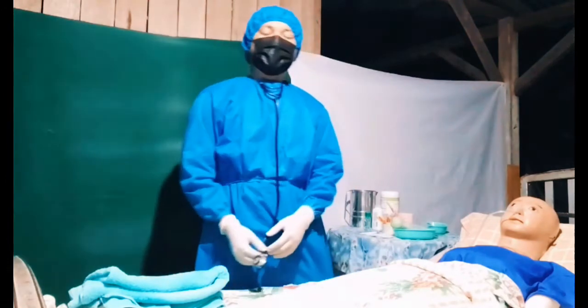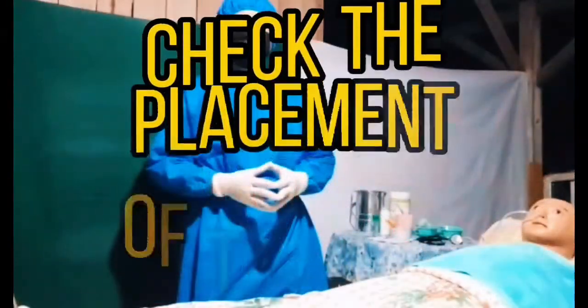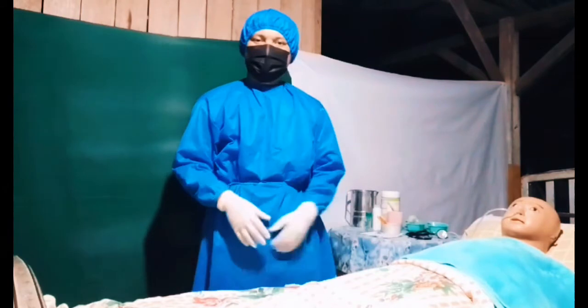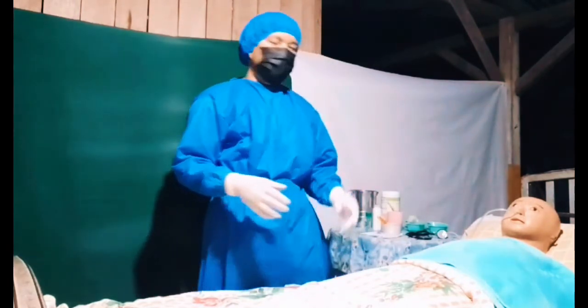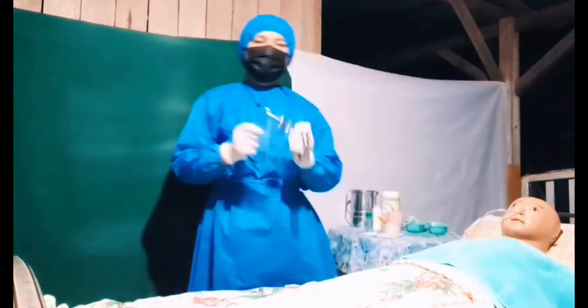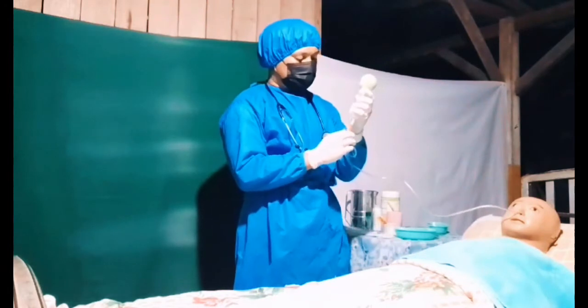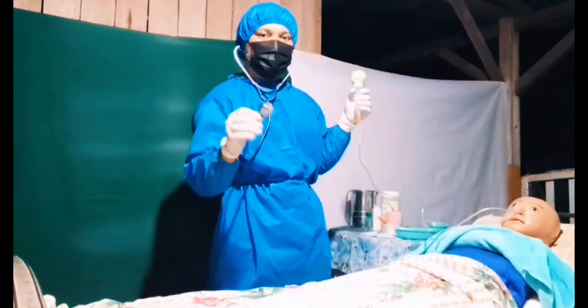So again, check the placement of the tube. Now, to make sure that the tube is in the stomach, you must check the placement of the tube. We're going to need a stethoscope and a septo syringe. Put a septo syringe in the tube. That's right. Put the stethoscope on the stomach. Introduce air.